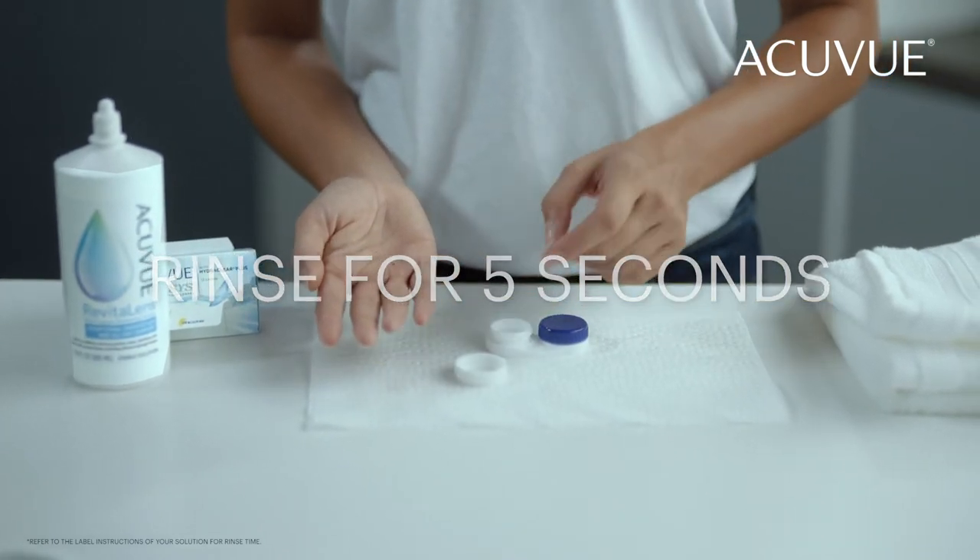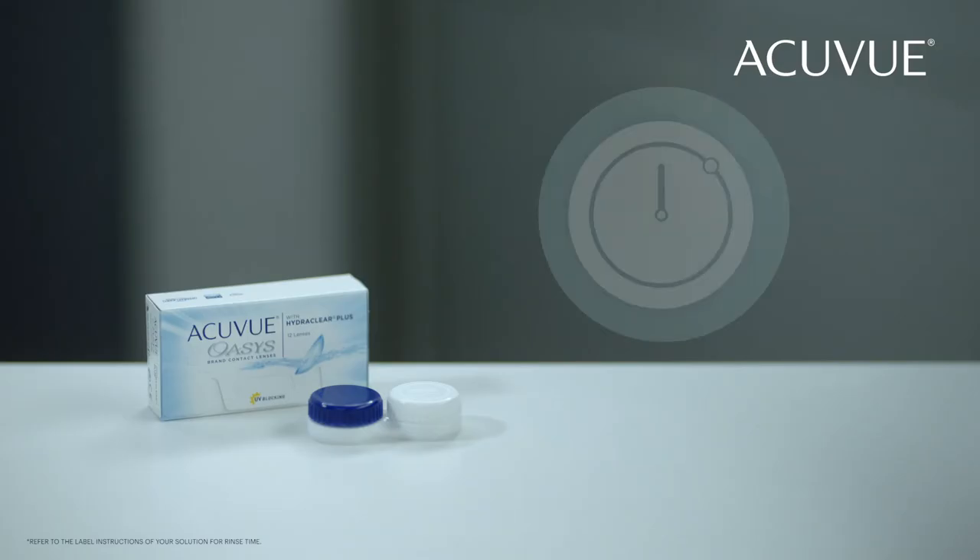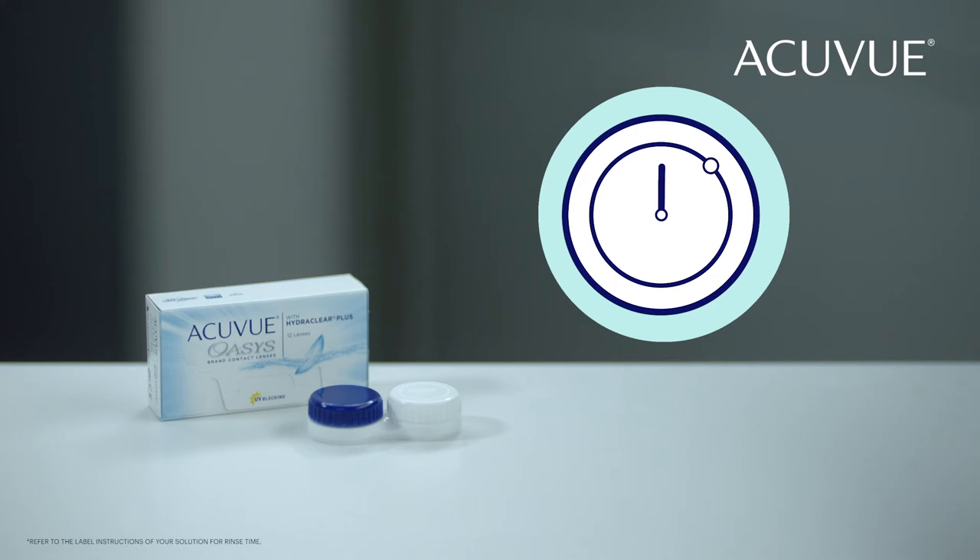Once you're done, place them in your contact lens case and close it tightly. Now that your contact lenses are clean, it's important to disinfect them. Simply soak them in disinfecting solution overnight for a minimum of six hours.